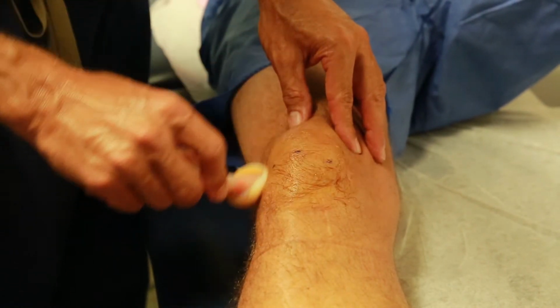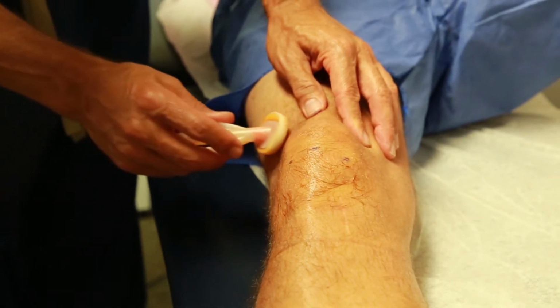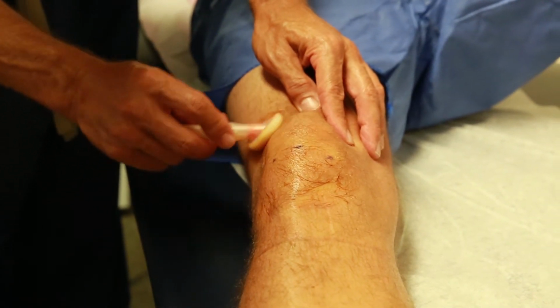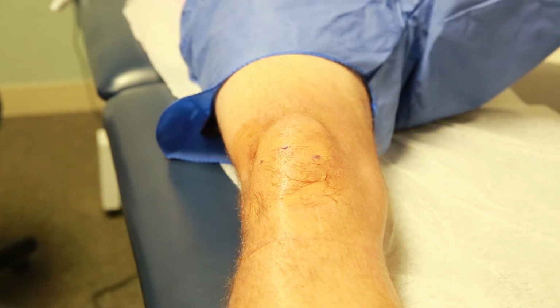So after we mark them, the next thing we're going to do is sterilize the area that we're going to go into. Now, oftentimes we'll go superior laterally. We'll sterilize this as well if we need to see the patellofemoral joint. And then once we do that, we will inject.